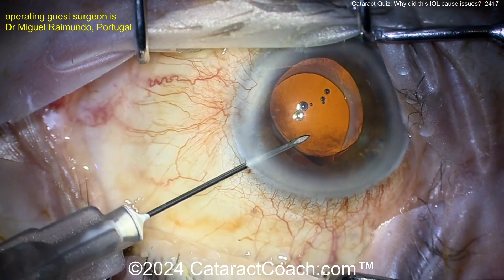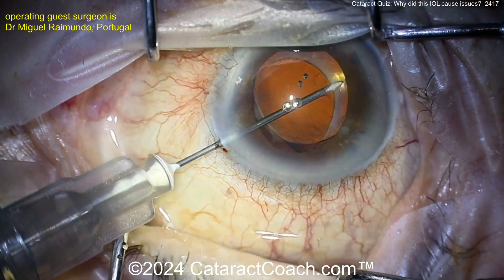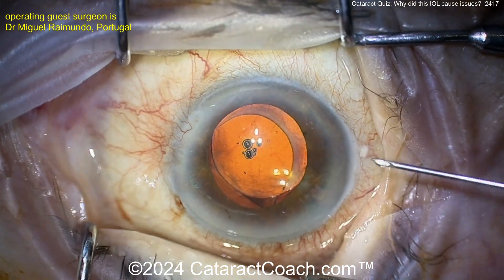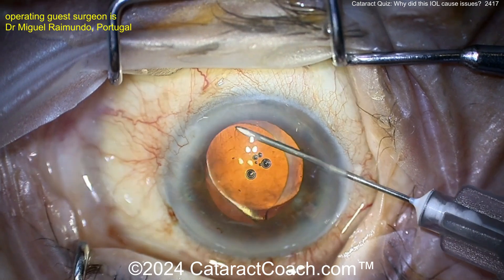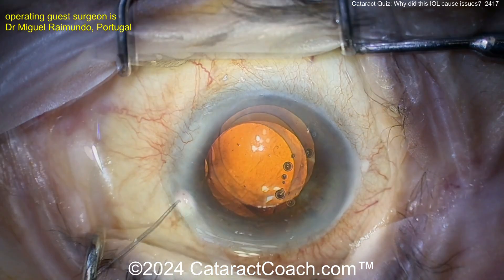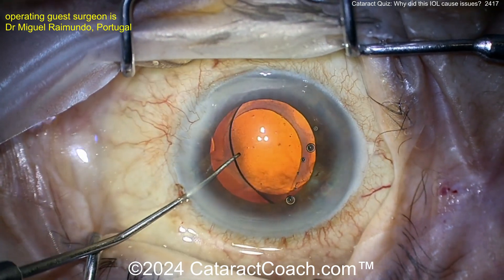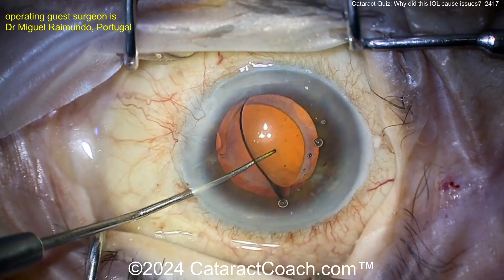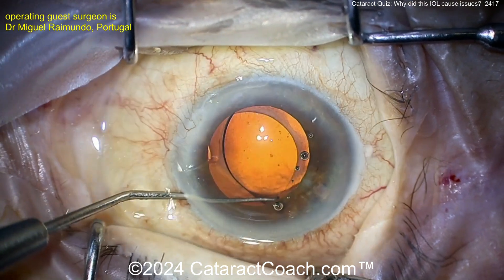The lens is a little de-centered — why is the lens de-centered? Let's do a little dissection here, get a needle under the rhexis edge to separate it. Look at the bottom of your screen: you've got one haptic outside the capsule bag. This is a case where one haptic's in the bag and one haptic's outside the bag. That's the problem. The bottom of your screen, which is the patient's superior, you've got a haptic that's out of the bag in the sulcus scraping the iris, causing the UGH syndrome.